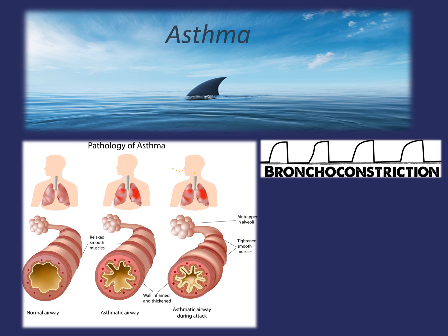As asthma worsens, end-tidal CO2 will be within normal ranges as we observe a steeper slope for phase 3 as the shark fin develops. Eventually, in severe asthma attacks, end-tidal CO2 will increase above normal levels and we will see a classic shark fin or shark wave appearance. Not only can we see these types of changes in our patient and predict their disease trajectory, but we can utilize capnography as we intervene.